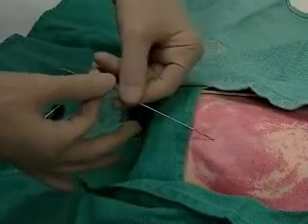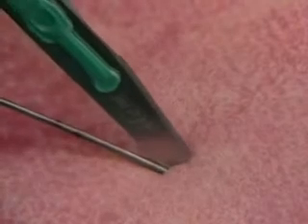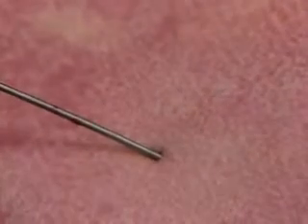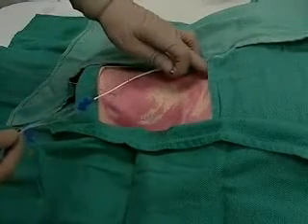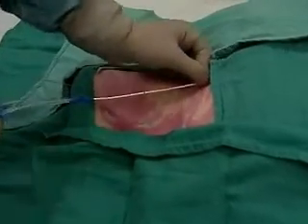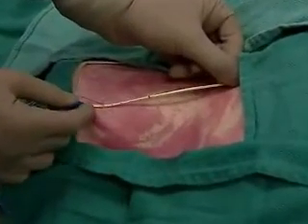And at this point, we'll take the 11 blade with the sharp edge up to make a small incision where the wire enters the skin. This will facilitate the passage of the catheter. Before we begin, we palpate that sternal notch. Lay the catheter tip at the sternal angle with the other end to the needle entry point, and we can see the catheter is the right fit for this patient.